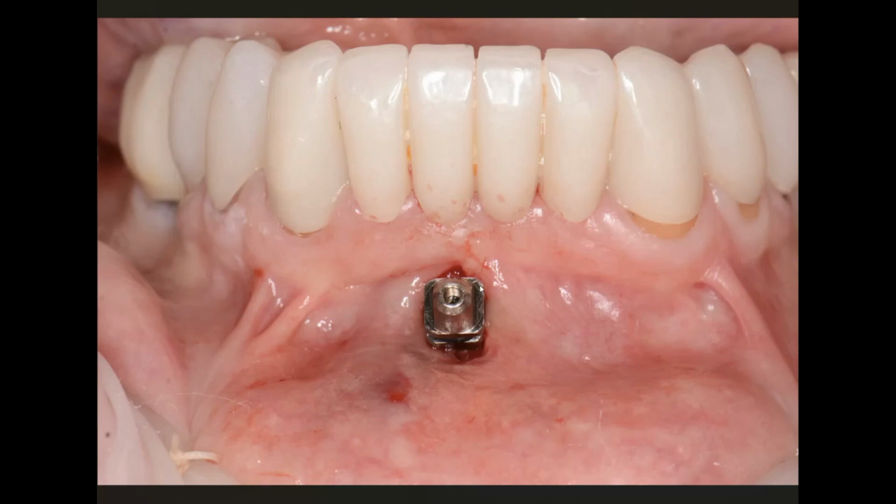But it goes in there really tight. And I'm telling you, I've done this on hundreds and hundreds of mandibles, and I've only encountered one or two soft mandibles that we actually had to worry about. But if you come to my digital workflow class, I'll show you a workaround on that. But that's like the 0.1%.